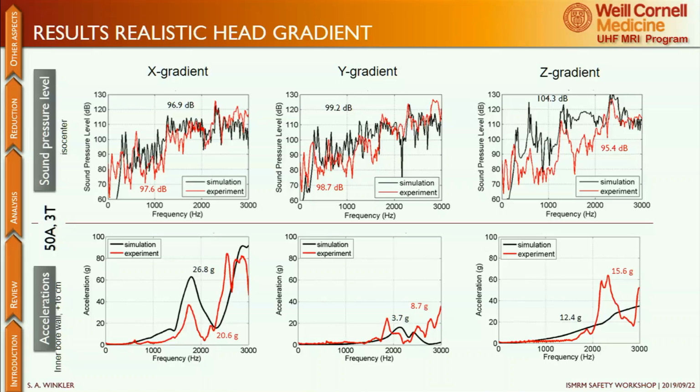And that's actually an interesting result, because now if you look at field dependence, you can analyze the situation without this term included, and then you can add the damping term, and suddenly this situation of having 10.8 dB more when you move from 3 Tesla to 10.5 Tesla is not showing up here anymore.